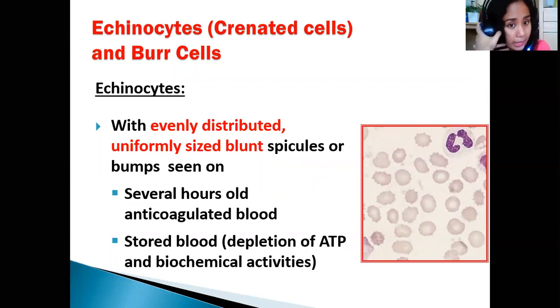Next, we have echinocytes or crenated cells and burr cells.